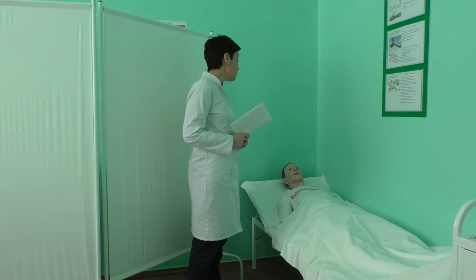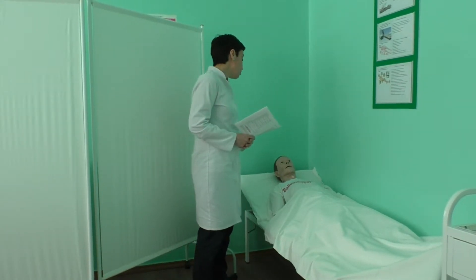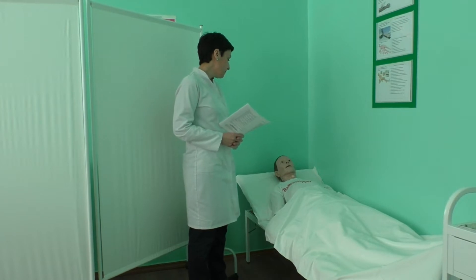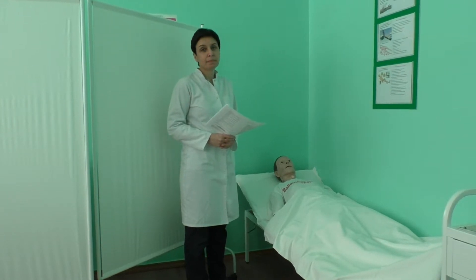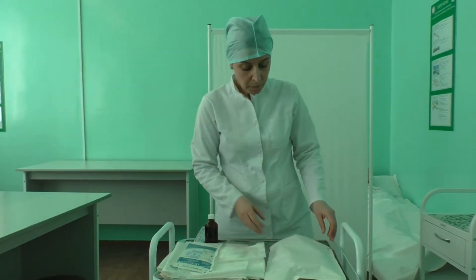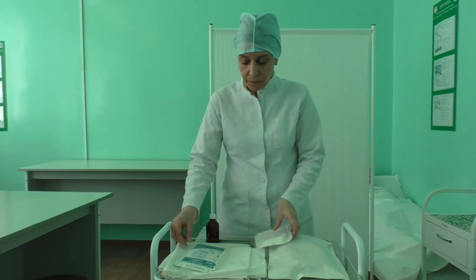Read your patient. Identify your patient using two identifiers. Take an oral informed consent. Explain all the steps of the procedure to your patient. Verify the order for manipulation. Check there are no contraindications. Prepare all the equipment on the procedure trolley.